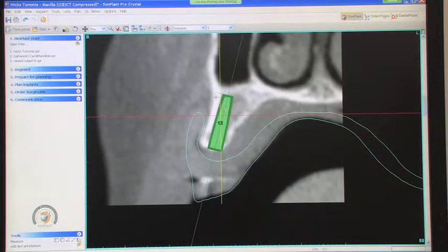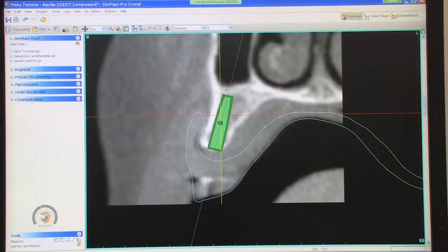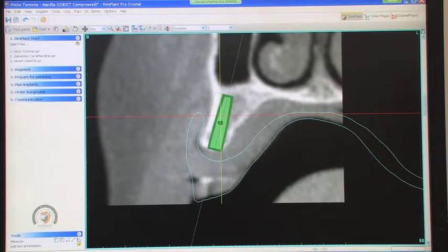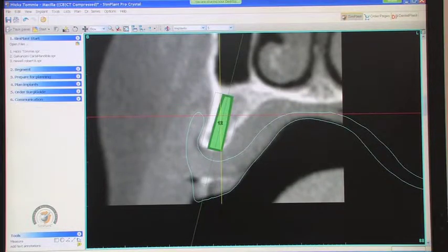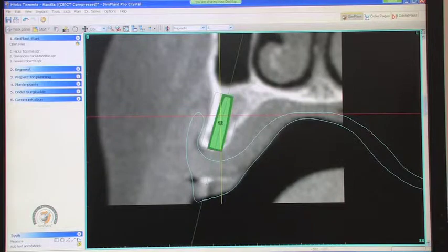Basically the same situation as the other side — looks like a reasonable amount of bone. The planned implant is 3.5 by 13mm, giving us really good depth and stability. The position looks good.